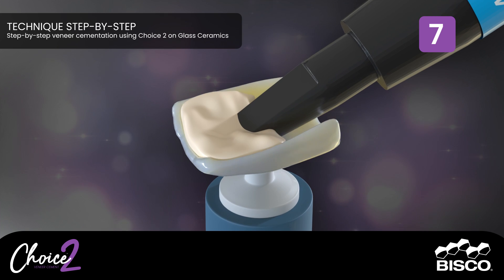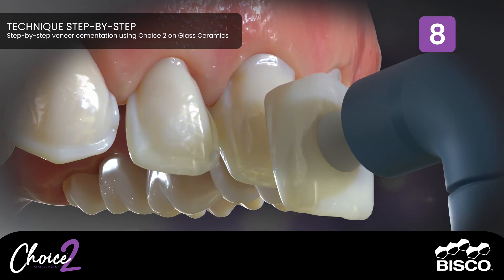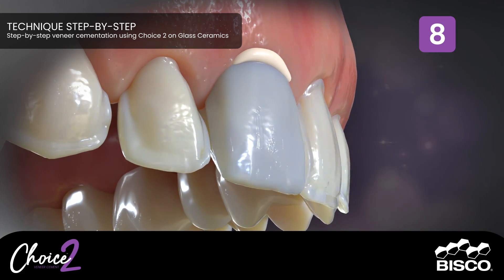Step Seven: Apply the selected shade of Choice Two to the internal surface of the veneer. Step Eight: Seat the final restoration and light cure for 40 seconds.